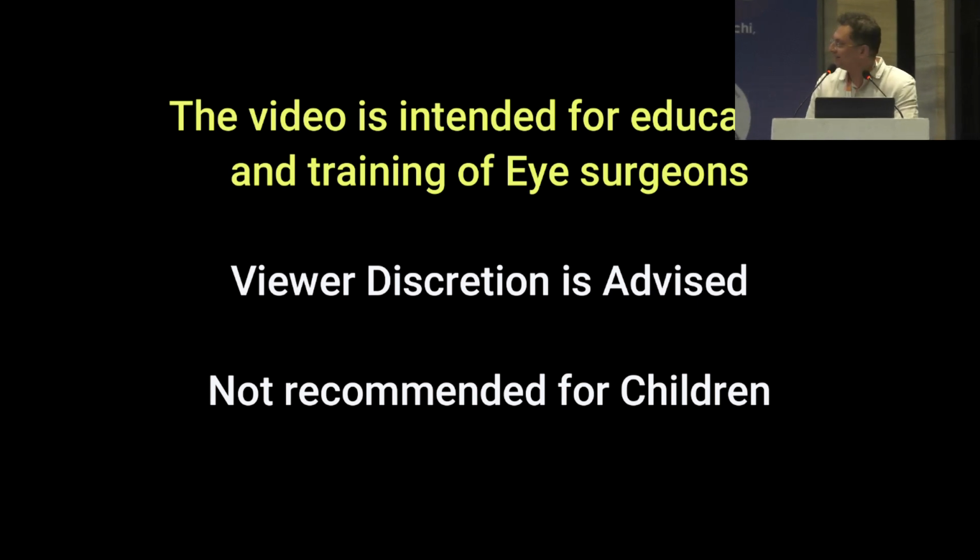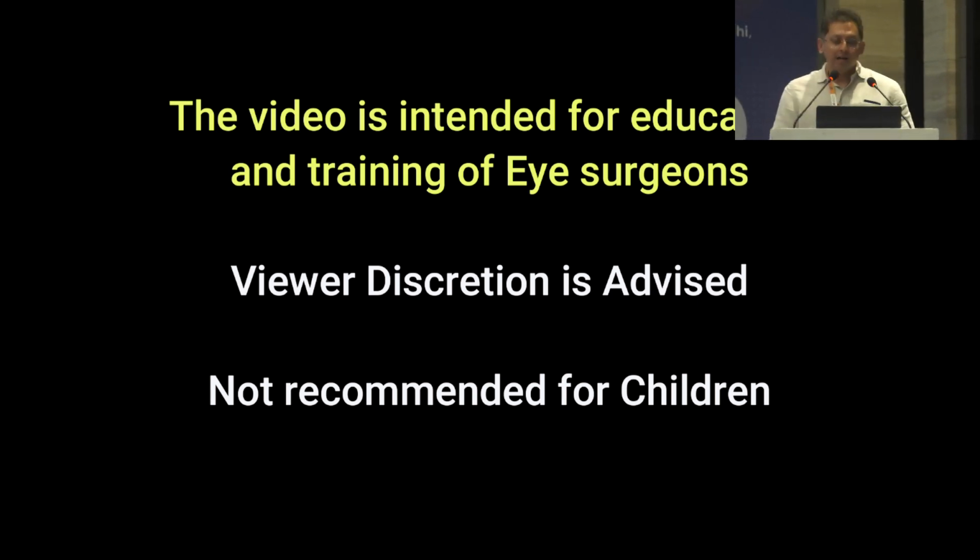I am also a retina surgeon. So the pars plana approach actually comes naturally for retina surgeons, but I was surprised that for my phaco cases, I hardly use the pars plana anterior vitrectomy approach as a routine. But there are certain situations where it's really useful.